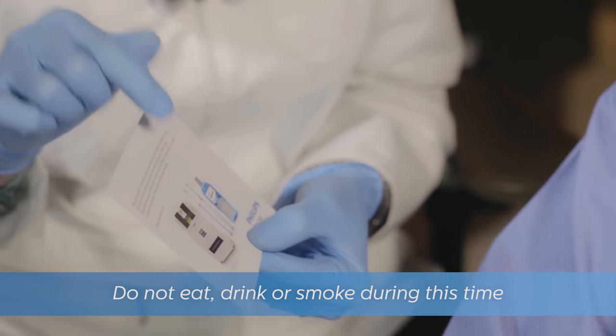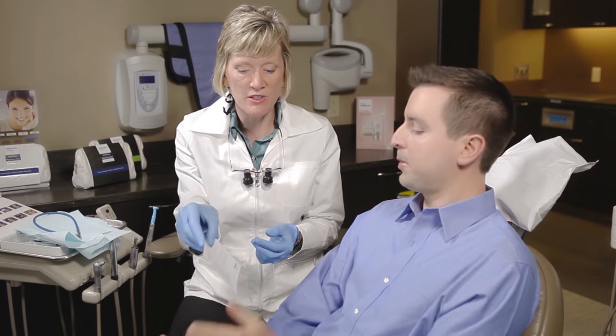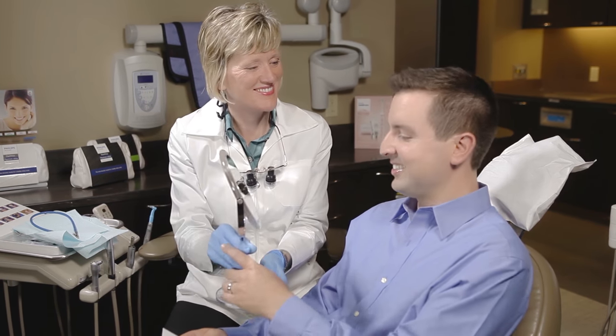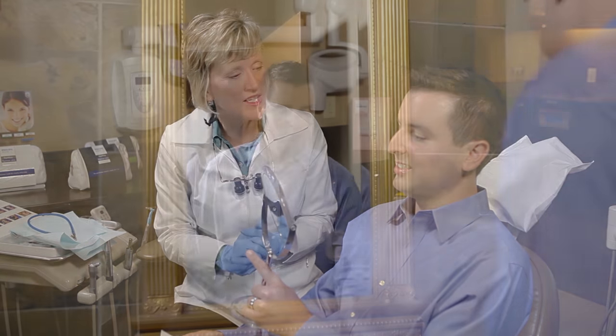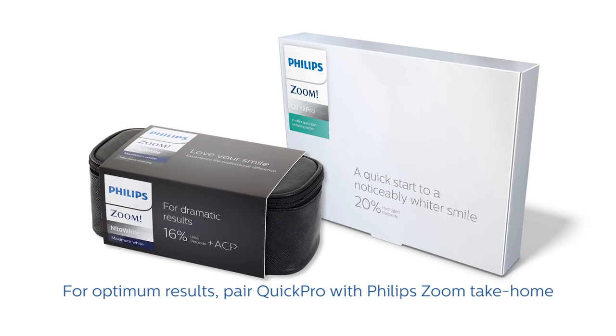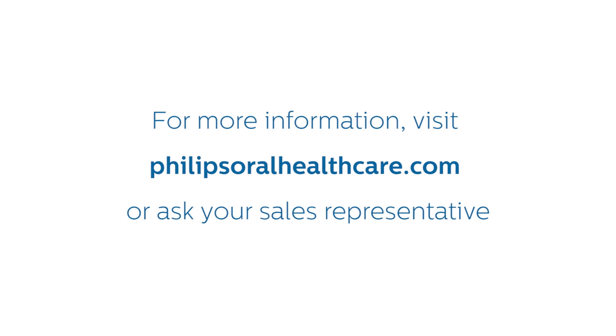The patient should not eat, drink, or smoke during this 30-minute window, but can otherwise go about their day as the varnish is colorless and nearly invisible. To remove the Philips Zoom Quick Pro whitening varnish after 30 minutes, the patient can either brush their teeth or wipe the film off with a damp cloth. For best results, patients should avoid dark staining foods and drinks as well as smoking for 2 hours after brushing. If your patients are looking for even more dramatic results, recommend they use Quick Pro in combination with Philips Zoom Day White or Night White Take Home Treatment. For more information about Philips Zoom Quick Pro, visit philipsoralhealthcare.com or ask your sales representative.